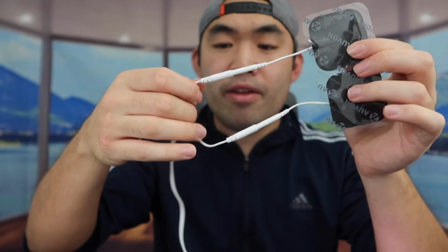And once you do that, you basically want to put it onto your arm or wherever you want to use this. So just for this test, I'm going to put it on my arm to show you what it actually looks like. So you want to peel it out and just put it onto your arm wherever you want to use it. So I'll probably put it somewhere around here. And just stick it on. And you basically want to stick on the other one as well. So just stick it on just like this.